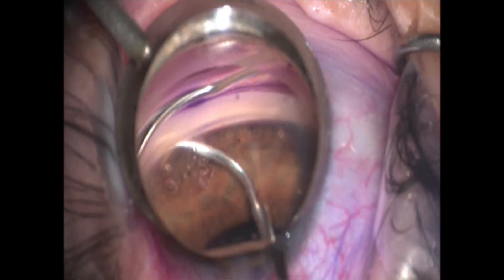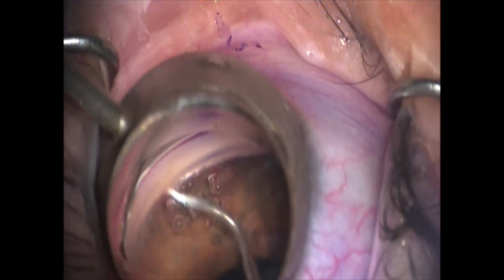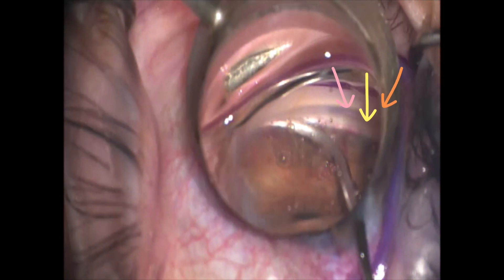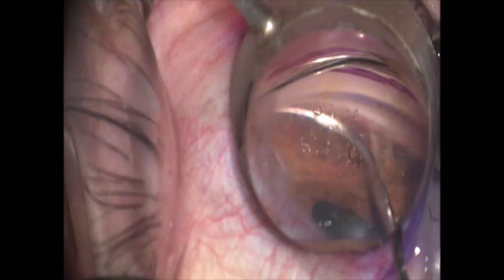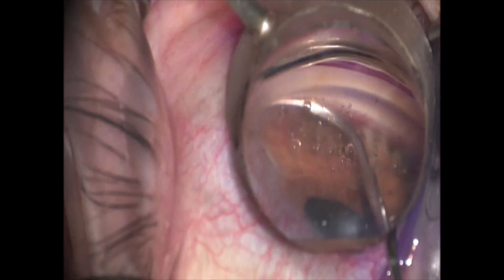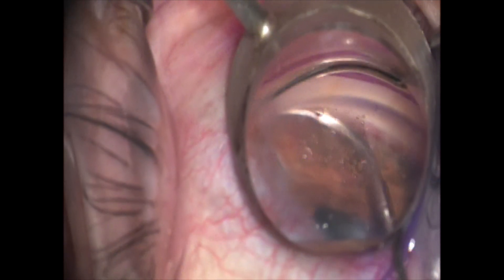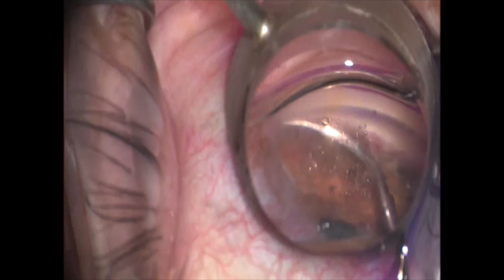This patient is getting a small goniotomy, so once I've injected all my viscoelastic I'm actually creating that goniotomy here for about three clock hours. There with the arrows you can see the VIA 360 quite easily being retracted back through the canal. I'm just going to slowly retract this for the full 360 degrees. This is a nice straightforward video of the new VIA 360.